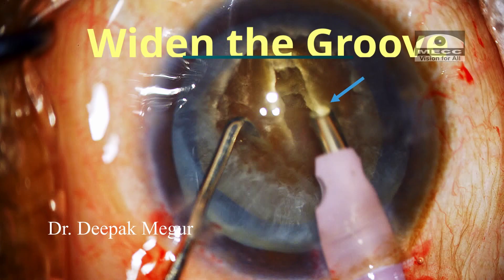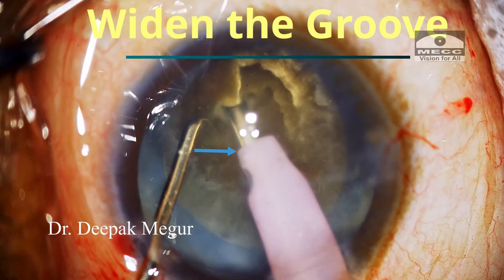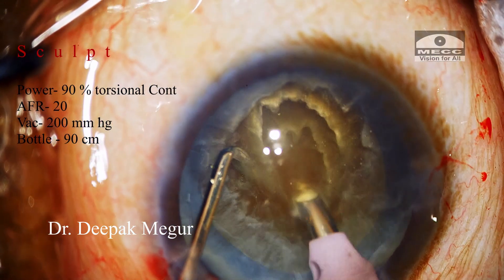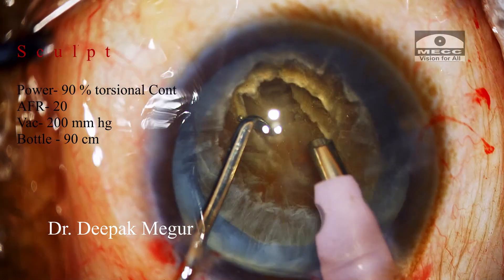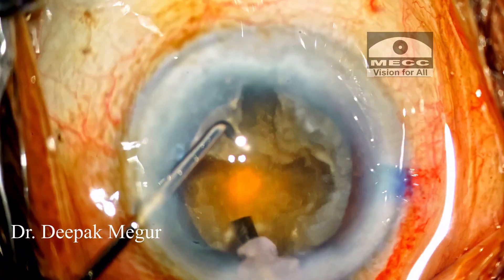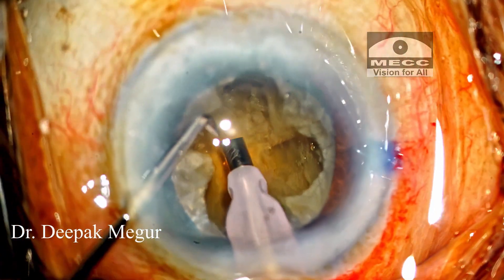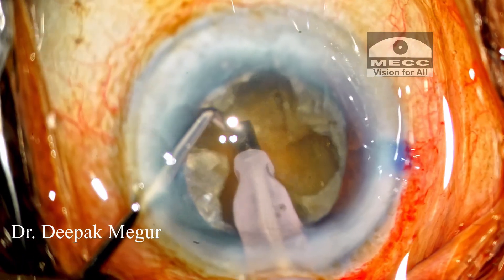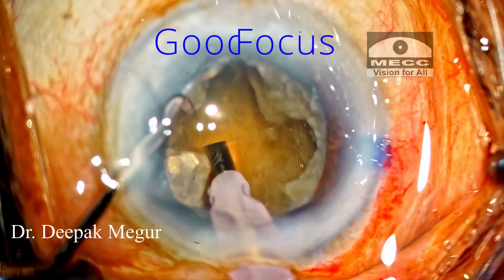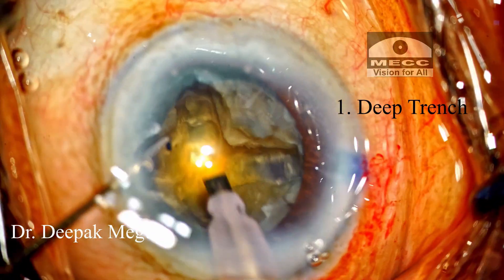Secondly, we can see that the superficial portion of the groove is widened so that there is no hindrance for the tip and sleeve to travel deeper into the substance of the dense nucleus. Once we have a wider trench, a deeper trench is so much easier to create, which is very critical in these hard cataracts. An important practical tip: to create deeper trenches and to laterally separate them, we need to be seeing things very well — we should have an idea how deep our trench is and where our instruments are placed. So it's important that we get the focus of the microscope spot on the place we intend to — that would be the posterior plate.